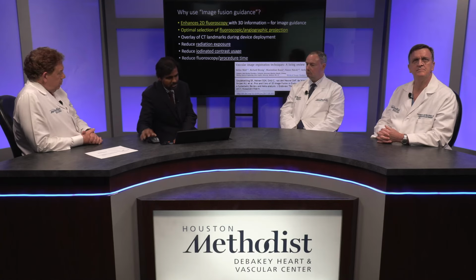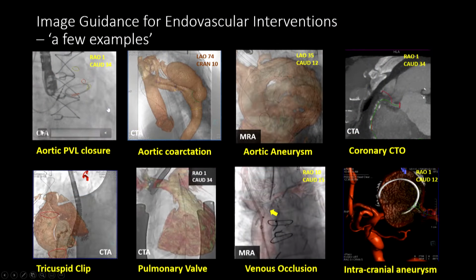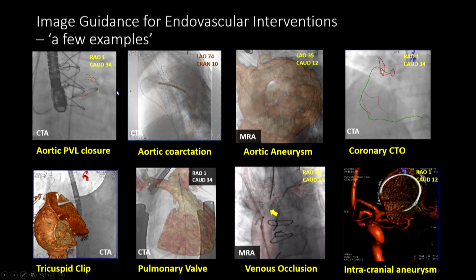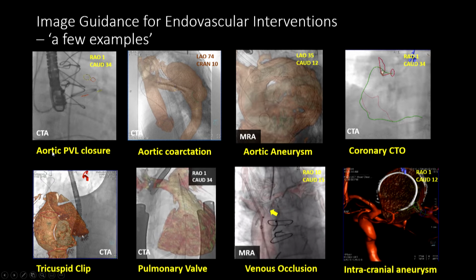And I kind of wanted to show this one slide. We went through that case example of thoracic branched endoprosthesis, and this is another example showing an array of case examples. From most of these cases, I have had the privilege to be there and learn from these cases. So it's not just thoracic endograft, it has applications on so many vascular beds.